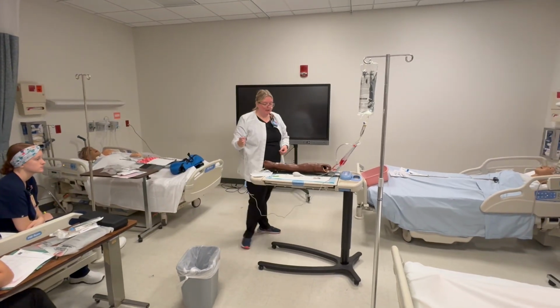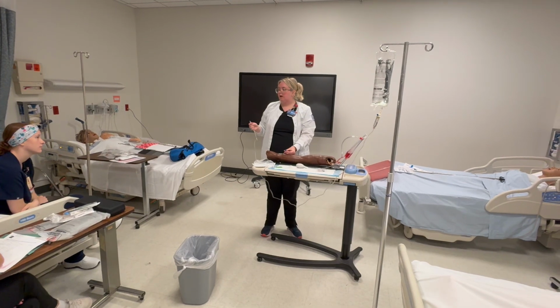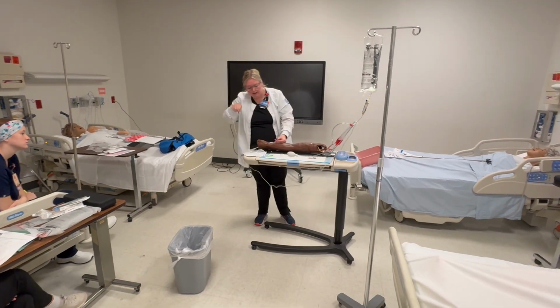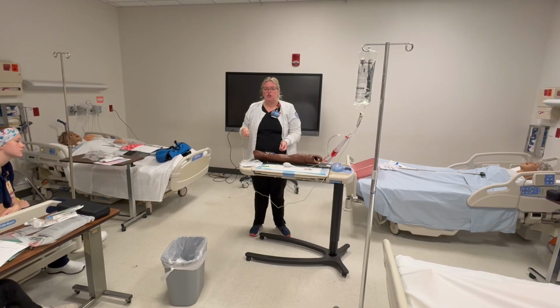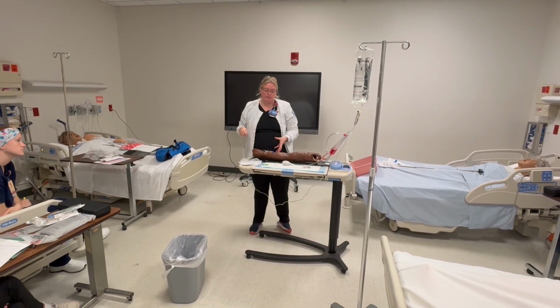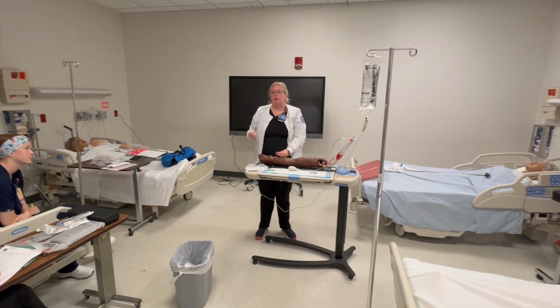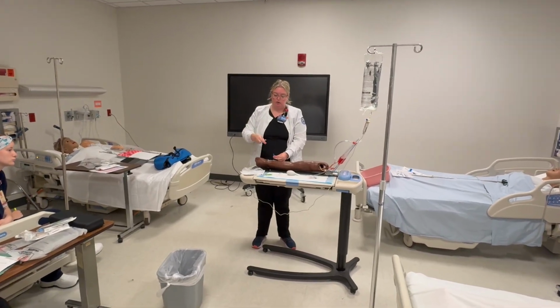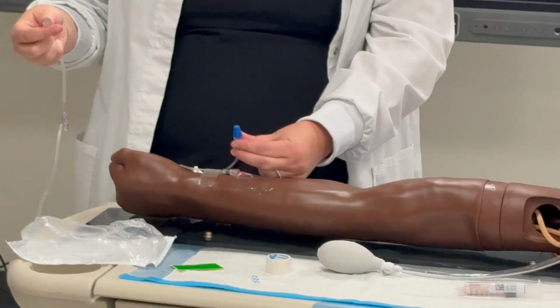I'm gonna come over here. Should I just connect these two? Why do we alcohol swab? Yep, while you're setting this up, the patient could be watching TV, moving. This just sits here. Sometimes they make alcohol caps that stay on, but not everywhere has that. So if you're ever unsure, it's never gonna hurt to re-alcohol. So, alcohol, 15 to 30 seconds, let it dry.